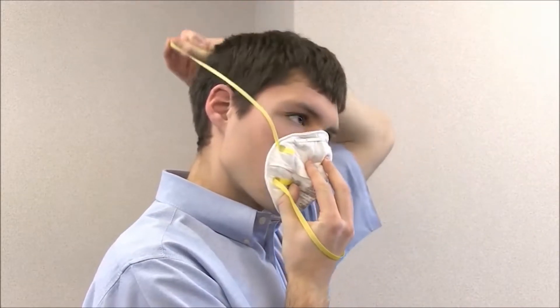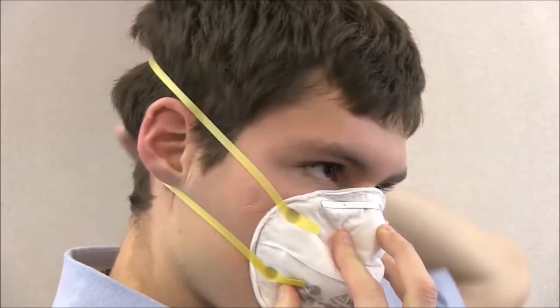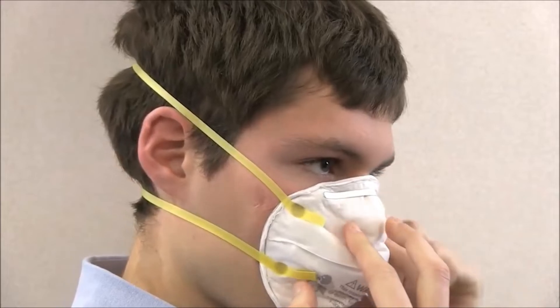While holding the respirator in place, stretch the top strap over your head and place it on the crown of your head above your ears. Continue to hold the respirator on your face and pull the bottom strap over your head and position it around your neck below your ears.